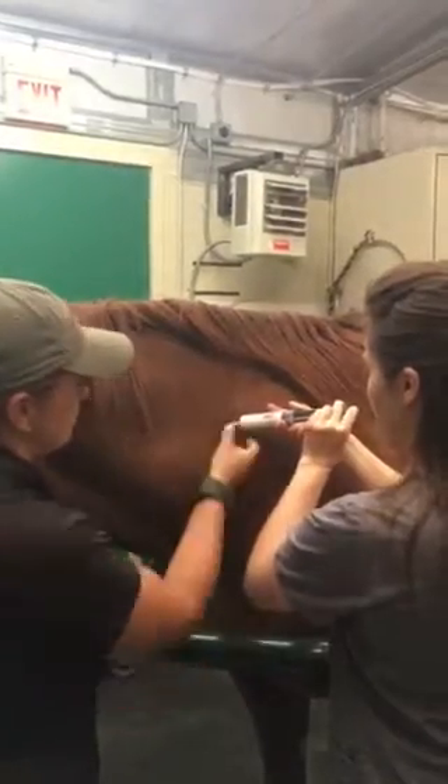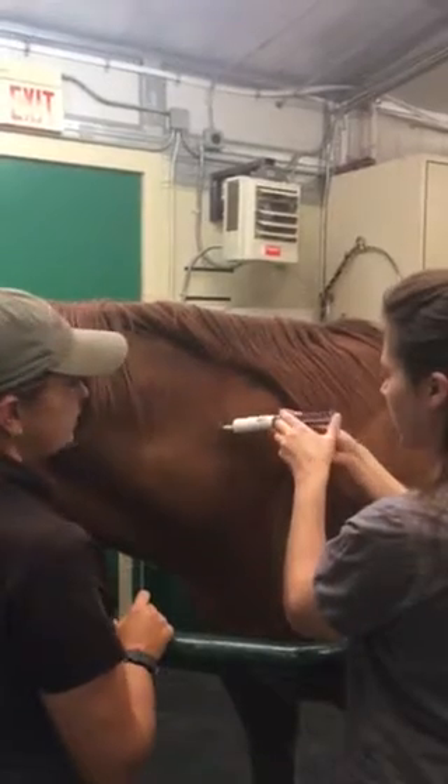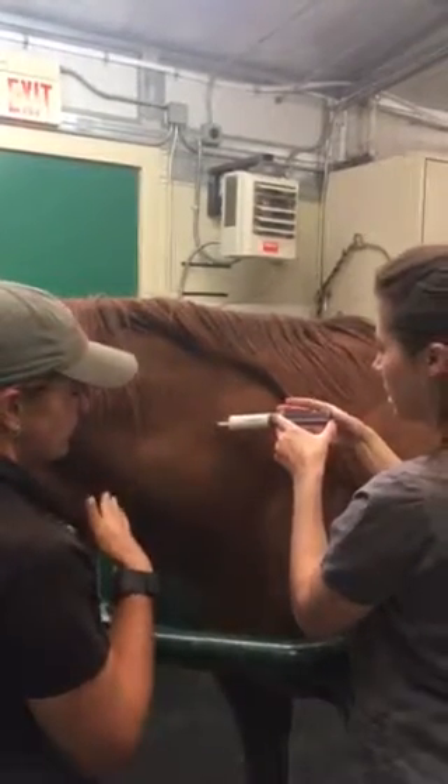You're going to have to pull really full. There you go. There's no blood, so give half of it. And if he was to jump or move at all, you're going to aspirate again.